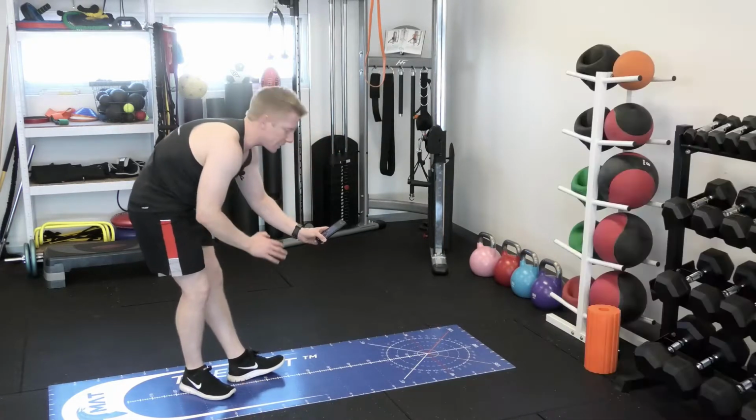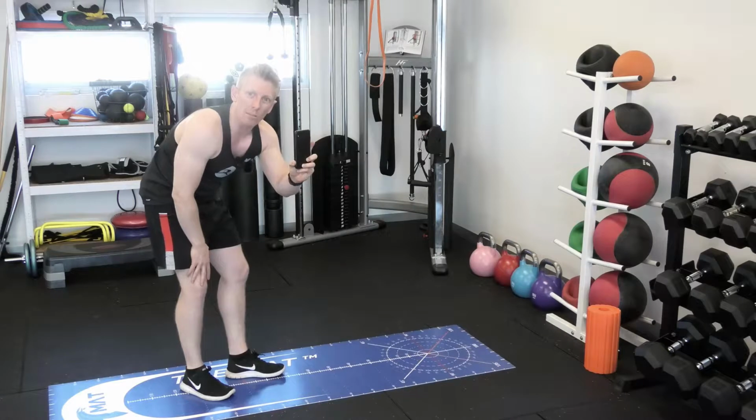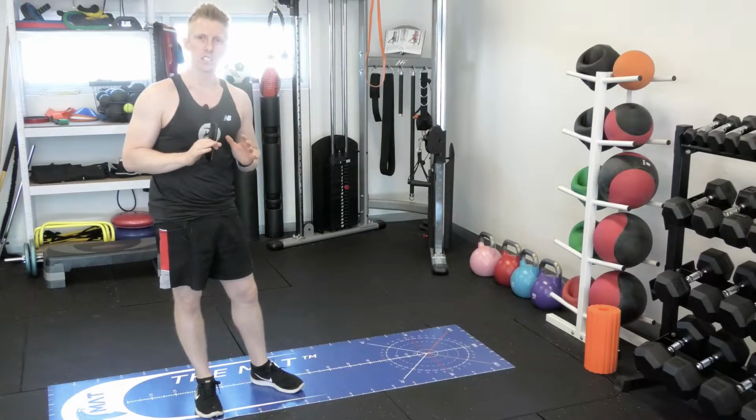And as you can see, it's bang on there, 90 degrees. And again, knowing that the mat's an accurate, reliable tool, we can see 90 degrees. This is exactly the same as what we see on the mat. So augmented reality could be a really nice way to get some accurate data around range of motion with your patients and clients. Just think about it.